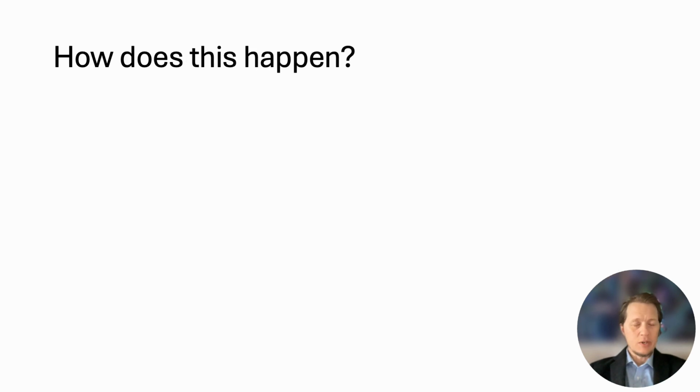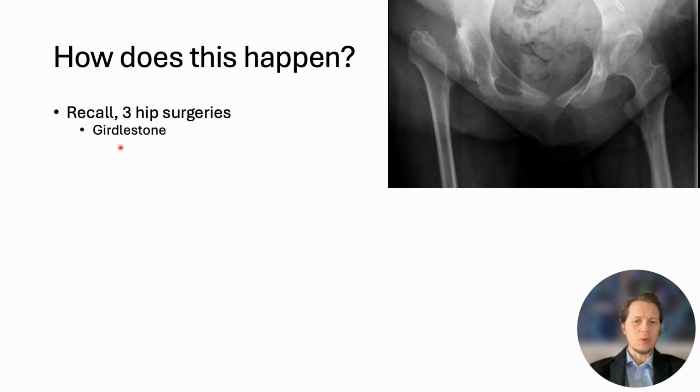Now, how did this happen, right? Well, in a way, it's like, gosh, how did this not happen? And it probably happened after maybe the first or second or third surgery, or just the years in the wheelchair, multiple surgeries. Here's a picture of Girdlestone. That is the empty hip, no ball. There's a socket that's left with acetabular bone loss because it's worn down, but femoral head, femoral neck, just nothing there. And this leg is just riding high, a chronically shortened leg.